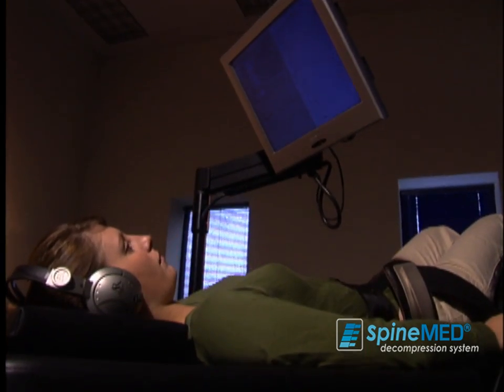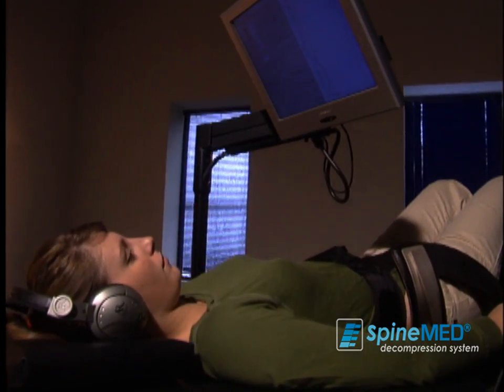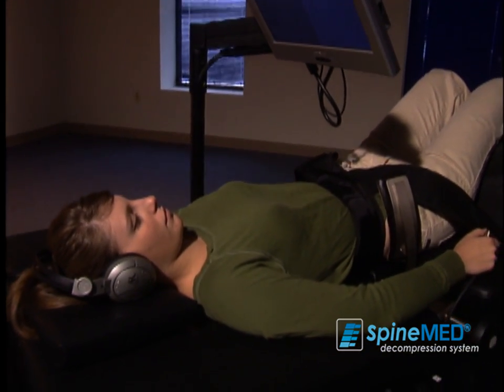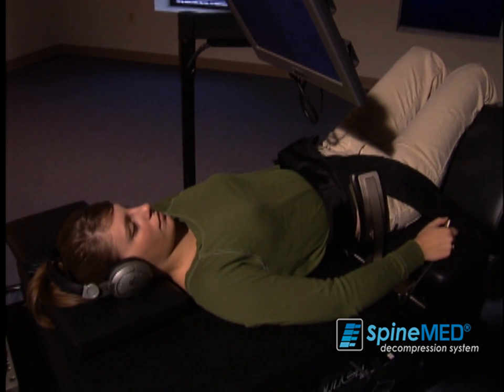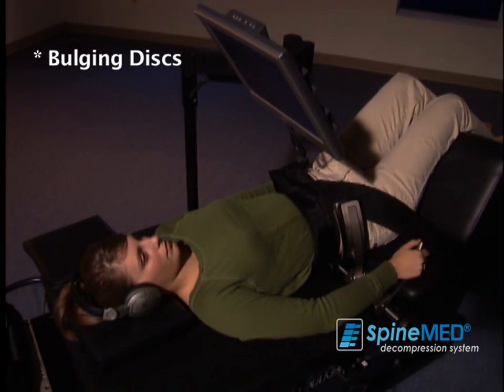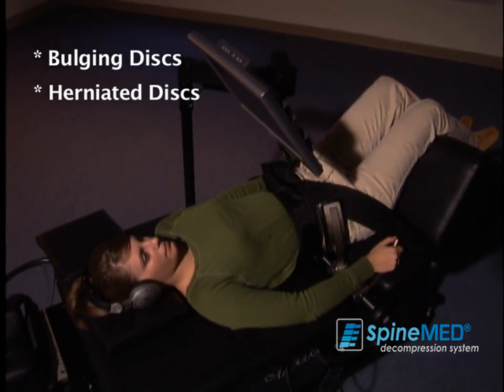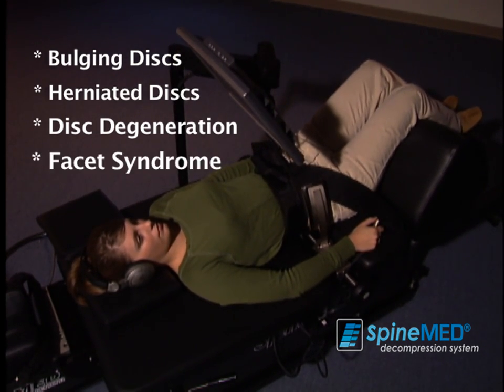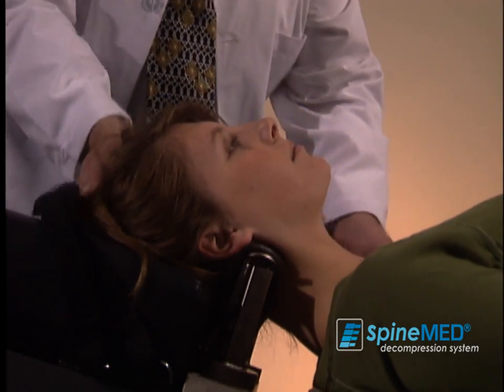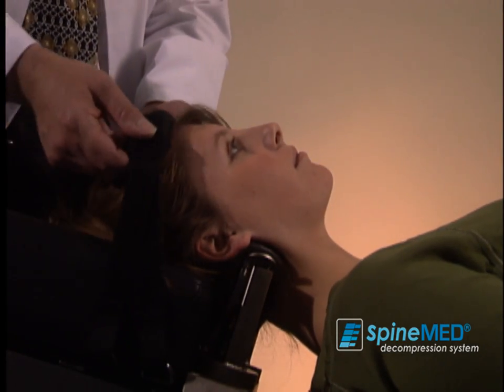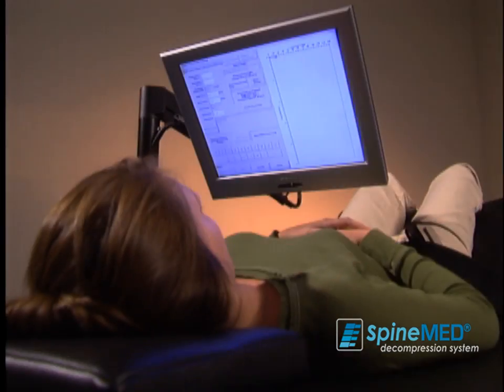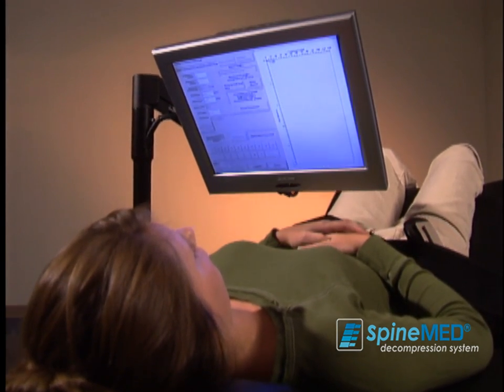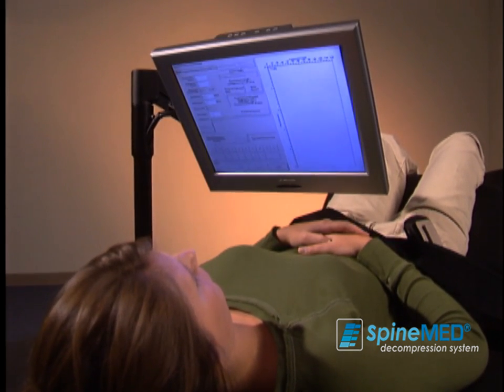SpineMed decompression therapy is a non-surgical, drug-free treatment that has been clinically shown to help reduce the disabling pain associated with bulging discs, herniated discs, disc degeneration, facet syndrome, and sciatica. The SpineMed decompression table acts to isolate and decompress spinal discs through distraction and positioning of the lumbar or cervical spine.